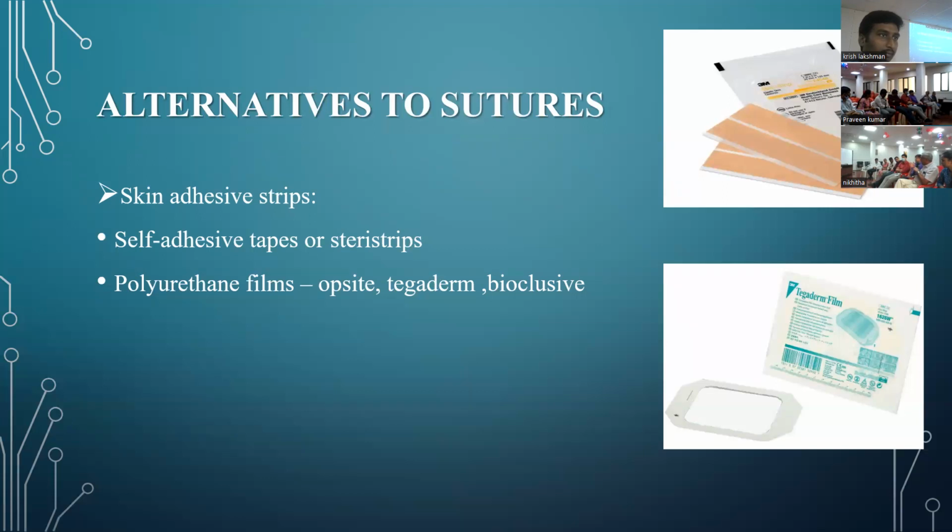But what is the advantage of the continuous suture? When the wound swells, which really does, the tension along the wound, along the suture, is uniformly distributed. So no segment of the suture has an abnormal tension. Whereas if you do locking, different segments have different tensions on them, and so it can actually cut through tissues in a particular segment when it swells. So I recommend that you do not lock sutures when you do continuous.